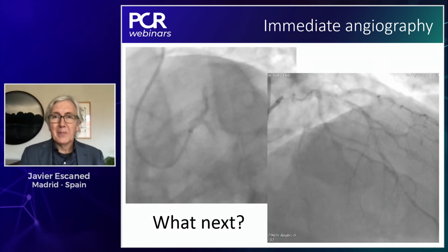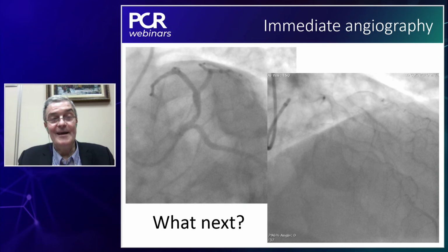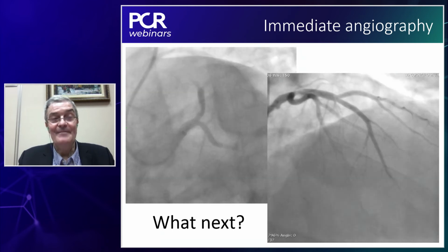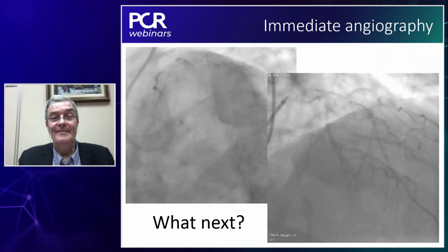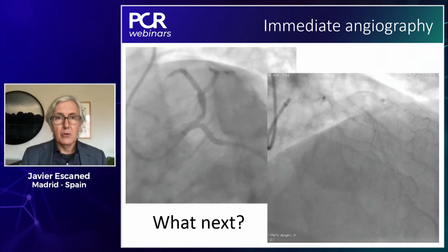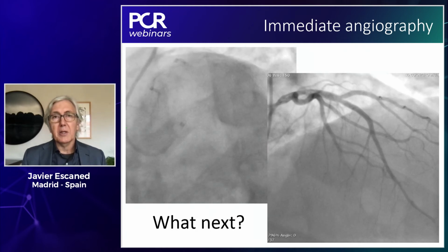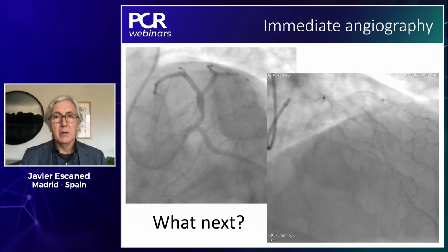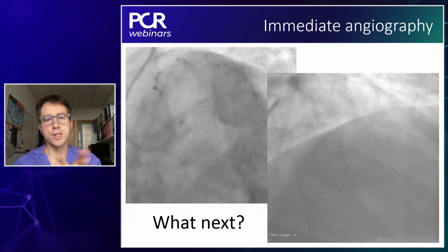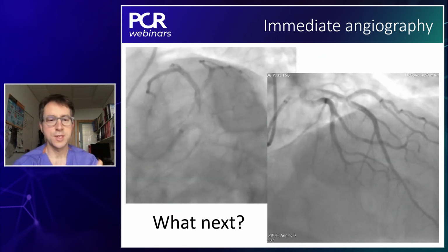I would expect, on ECG, Wellens sign in this kind of lesion in the proximal LAD. You certainly would not go for physiology here, because you are in the context of an acute coronary syndrome, so you will not make decisions based on physiology, because the subtended myocardial mass can be stunned by the ischemia. Javier, that was part of the reason for showing it, so that we don't have overlap in terms of considering physiology against imaging.